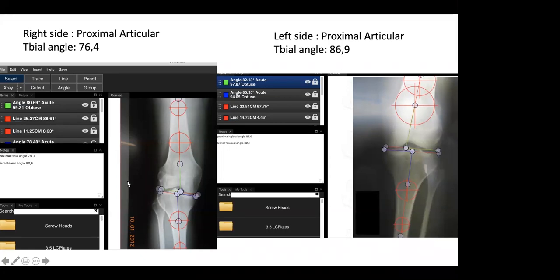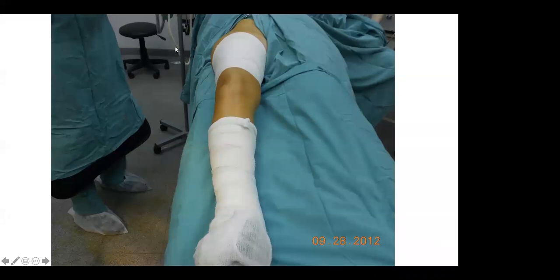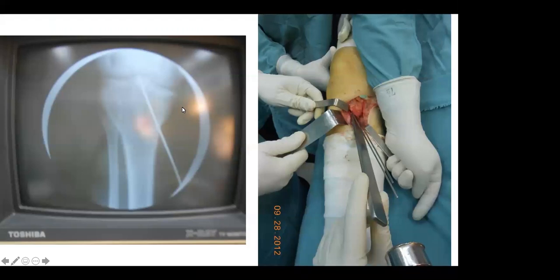Okay. I think that was a great discussion on being able to evaluate this. Here's in the operating room. And then here we see the plan for their osteotomy and doing an osteotomy of the medial condyle of the tibia. Looks like some guide wires are placed up, and then using an osteotome to follow the wires so that they get the osteotomy in the correct location. What technique do you like to use for these types of cases, Maurizio, or any of the other faculty?